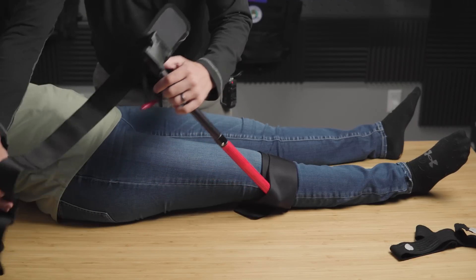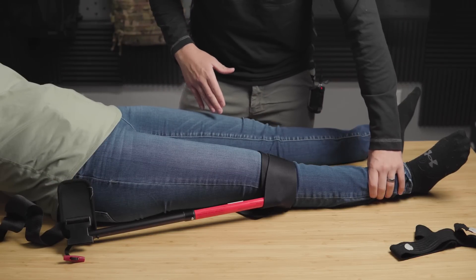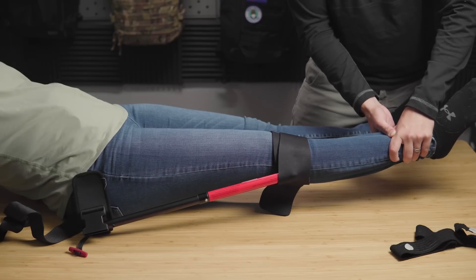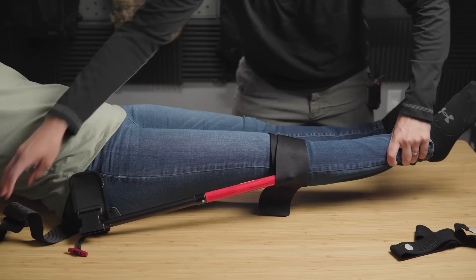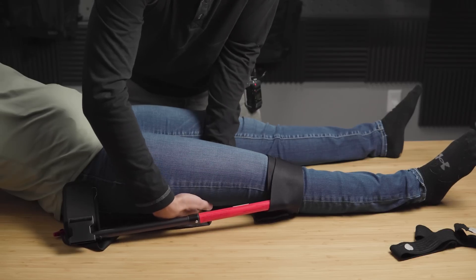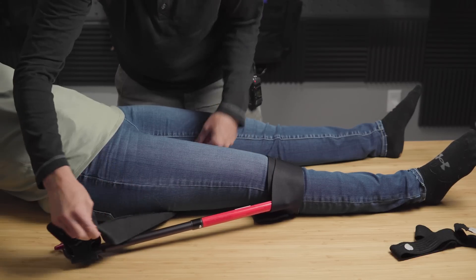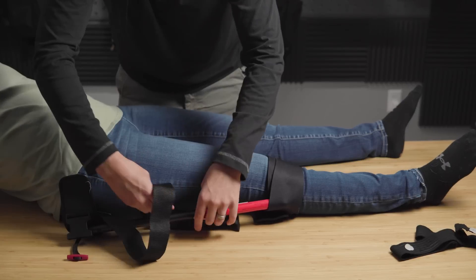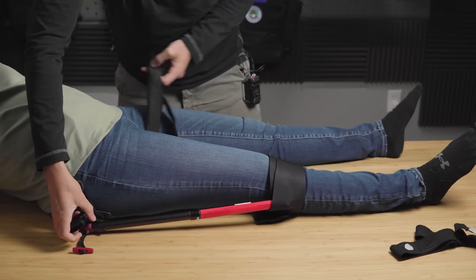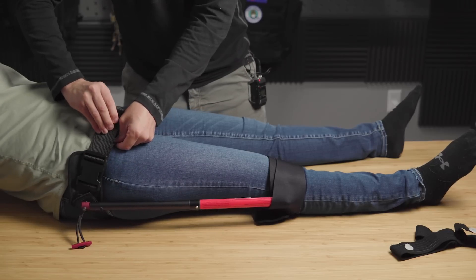Now we have the waist strap, and I'm going to feed this under the leg. One of the easiest ways to do this — if you have somebody pulling manual traction, they can lift the leg slightly. That's going to relieve some pain for the patient and let me slide the strap under with minimal movement. If I'm by myself, I can just kind of get it under the leg, being mindful of the injury to make sure I'm not making it worse or causing undue pain. We're going to slide this up into the groin a little bit. It doesn't need to be super tight, just snug. Tighten that down.